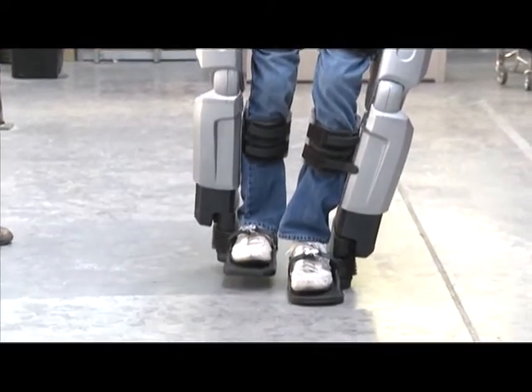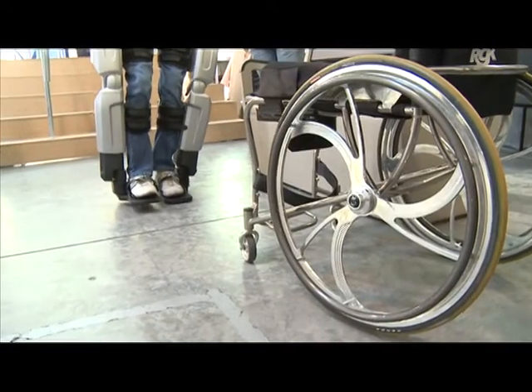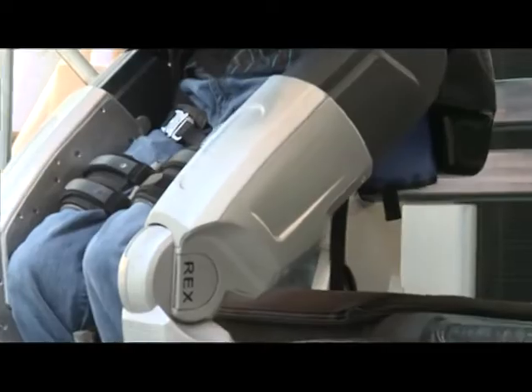I told the doctors after my accident that I was going to walk again. I didn't realize I was going to walk in a robot, but this is just blowing me away — being able to watch one foot in front of the other again. Couldn't ask for a better feeling.